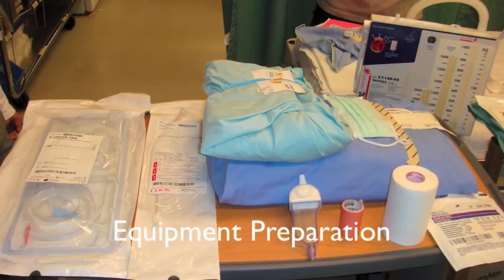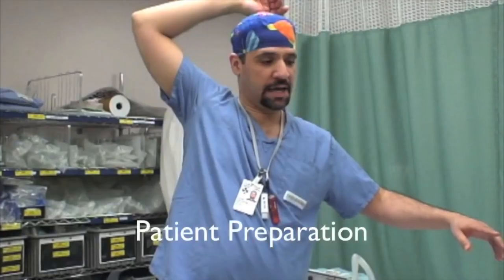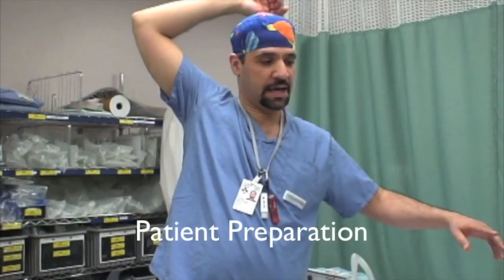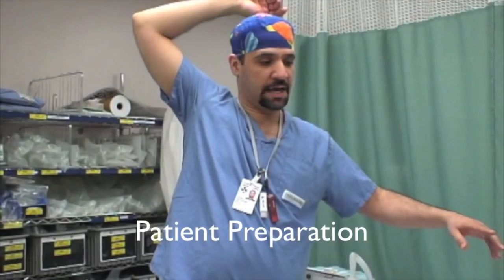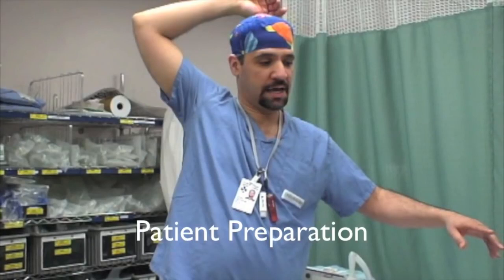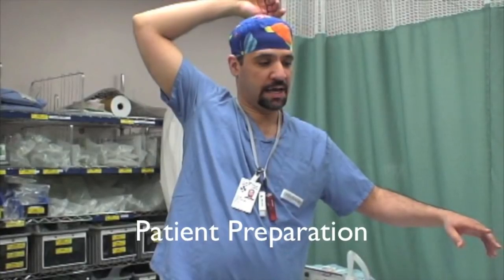Prepare necessary equipment. The complete list of required materials can be found in the document titled Pneumothorax Protocol, Small Bore Pigtail Catheter, Physician Orders. Position the patient supine. If patient condition allows, elevate the head of the bed to 30 degrees. On the affected side, place the patient's arm over the head, as demonstrated here.